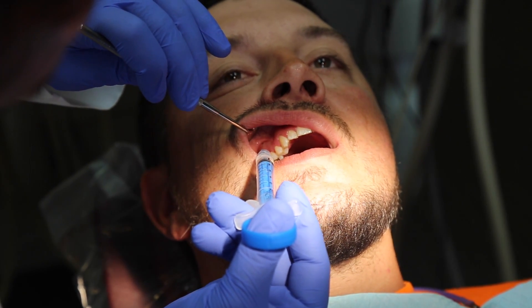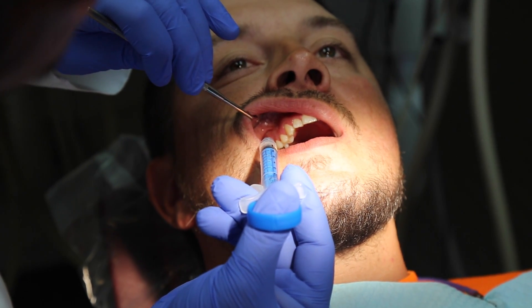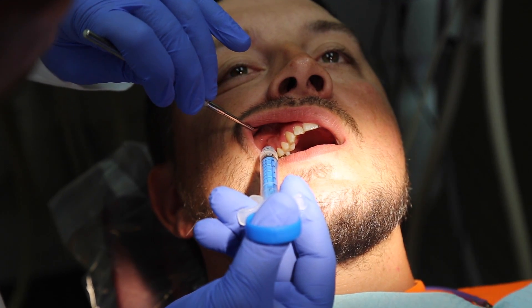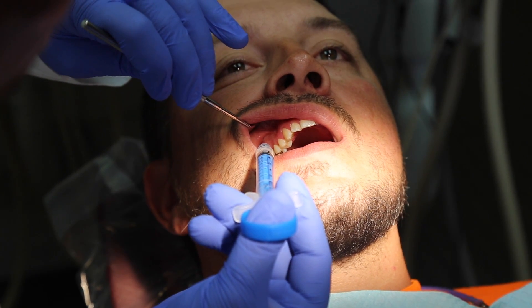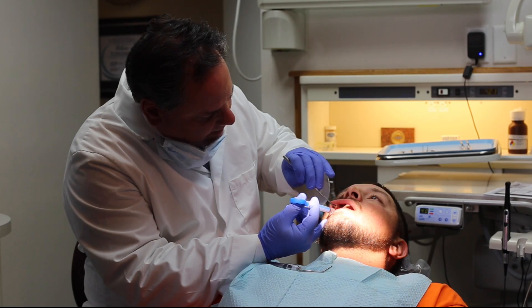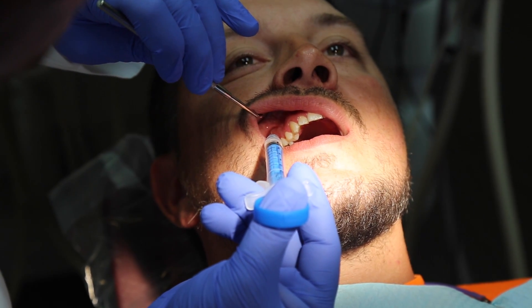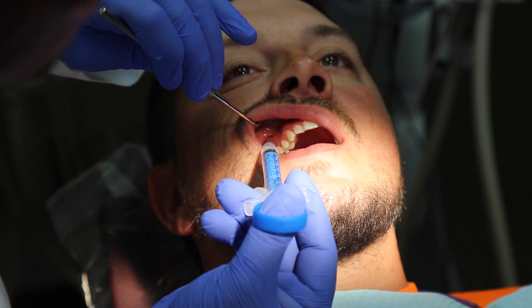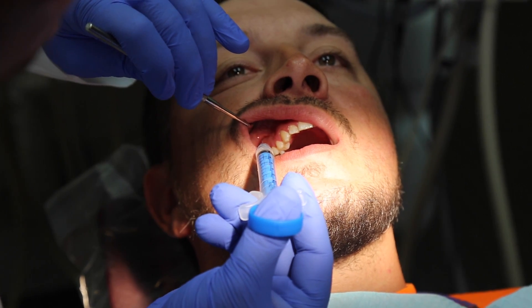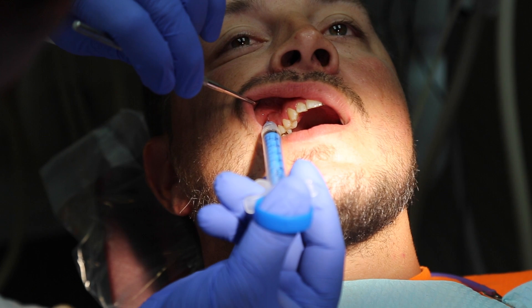Are you having any discomfort? Slowly dripping again — because it's a buffered solution, the anesthetic immediately absorbs through the bone and starts numbing up the sodium channels that transmit pain or discomfort. If you listen closely, you'll hear that little haptic tap-tap of the syringe, which lets me know that medicine is going in. Another nice feature is that the syringe itself is not that big old silver dental syringe — it's a very gentle-looking blue, so it's less intimidating to a patient if they happen to see it.